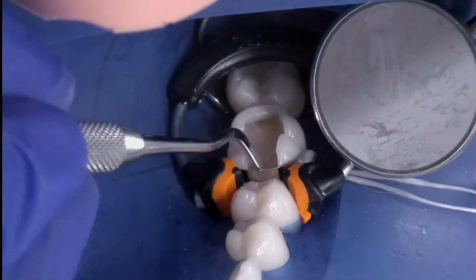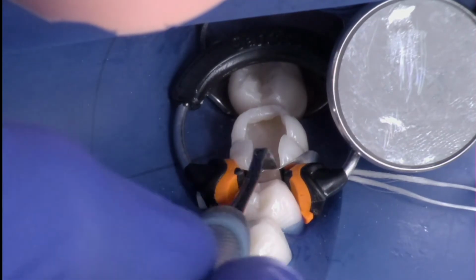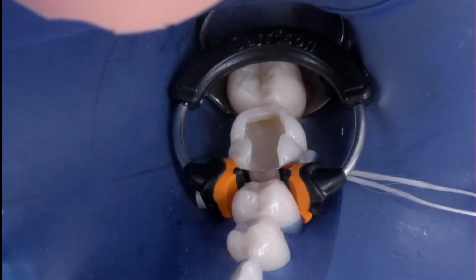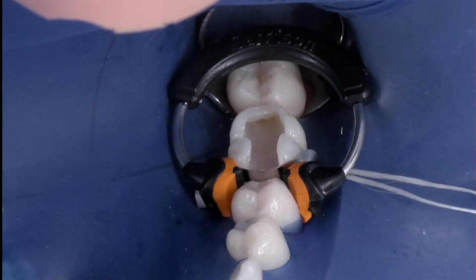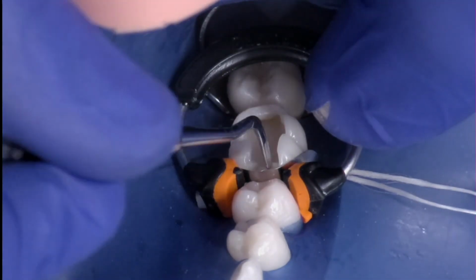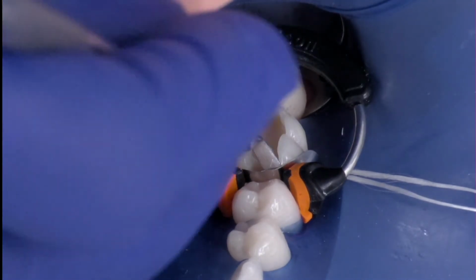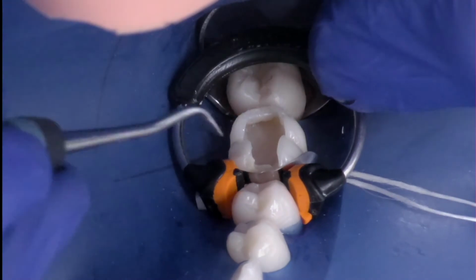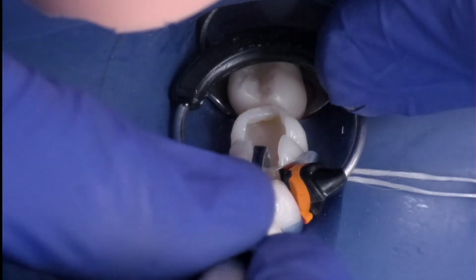Here I am just trying to build up that marginal ridge. I'm using an A3.5 shade, which is darker than the tooth, but I'm hoping to bring it back lighter with the enamel shade at the end. Again, trying to build up that marginal ridge. Another A3.5 shade layer.